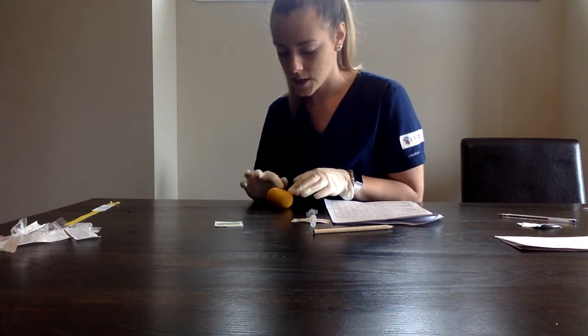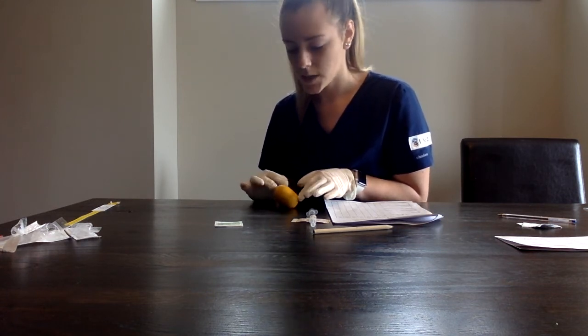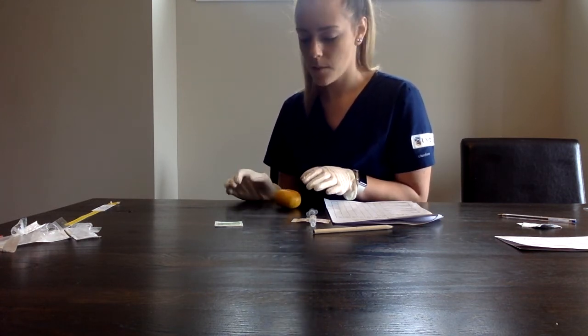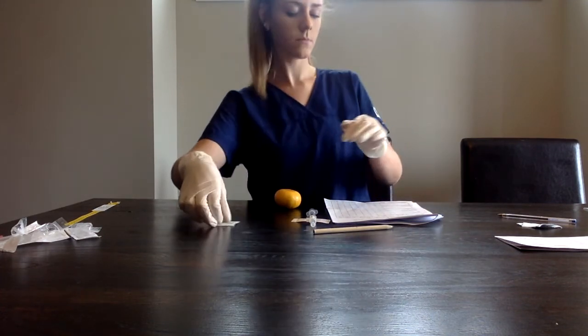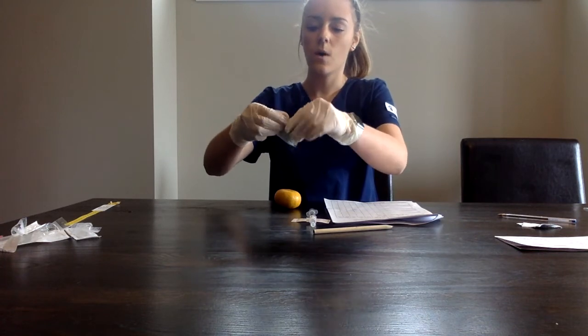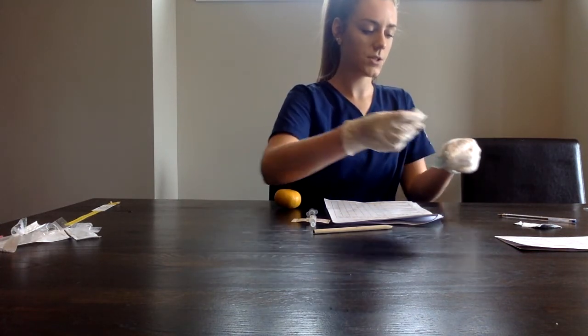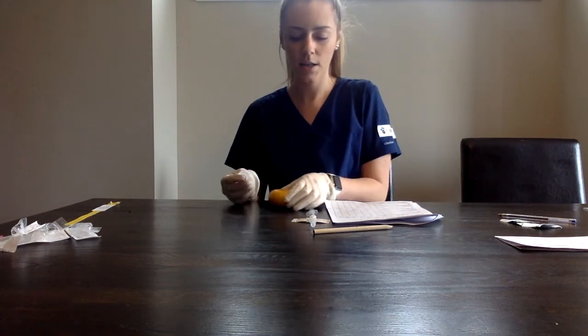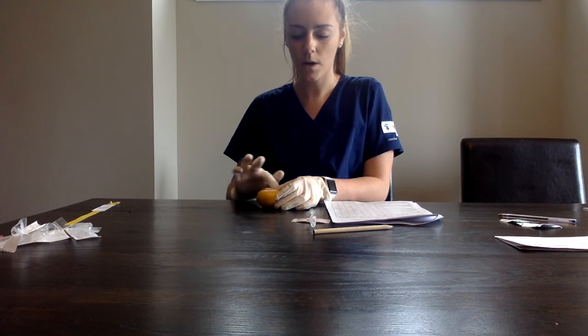So I am assessing Jake's abdomen here. It looks like there's no bruising that's present, so we're just going to pick the right side of the abdomen, and we'll do 5 centimeters away from the umbilicus. We'll take an alcohol swab, and we want to cleanse the area, starting inwards and doing a circular motion outwards. And we'll do that for 30 seconds.